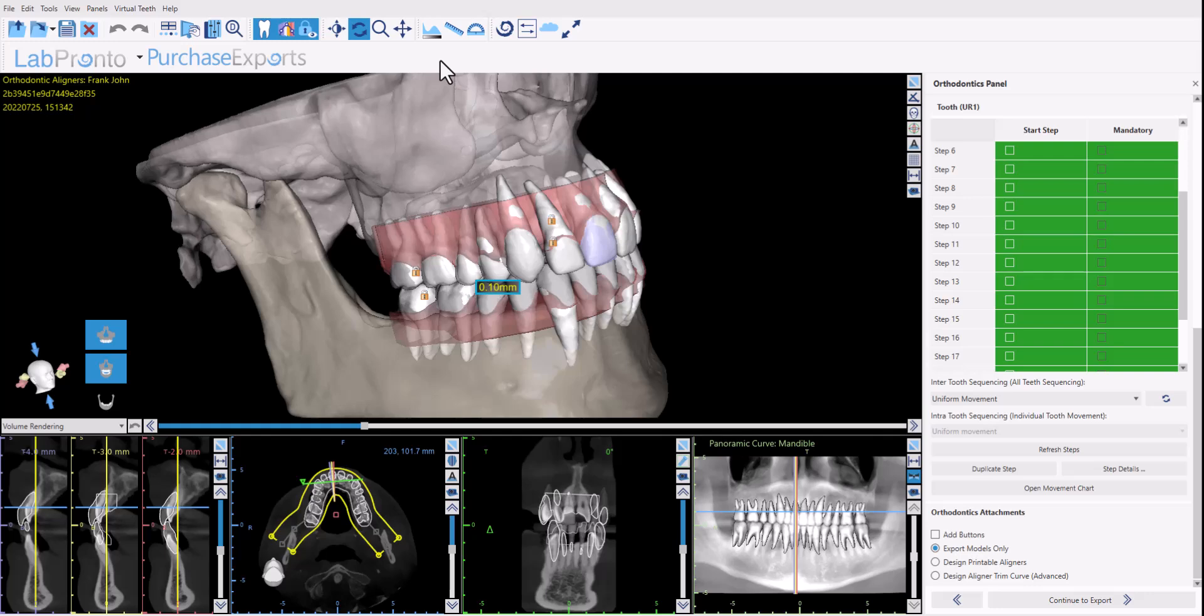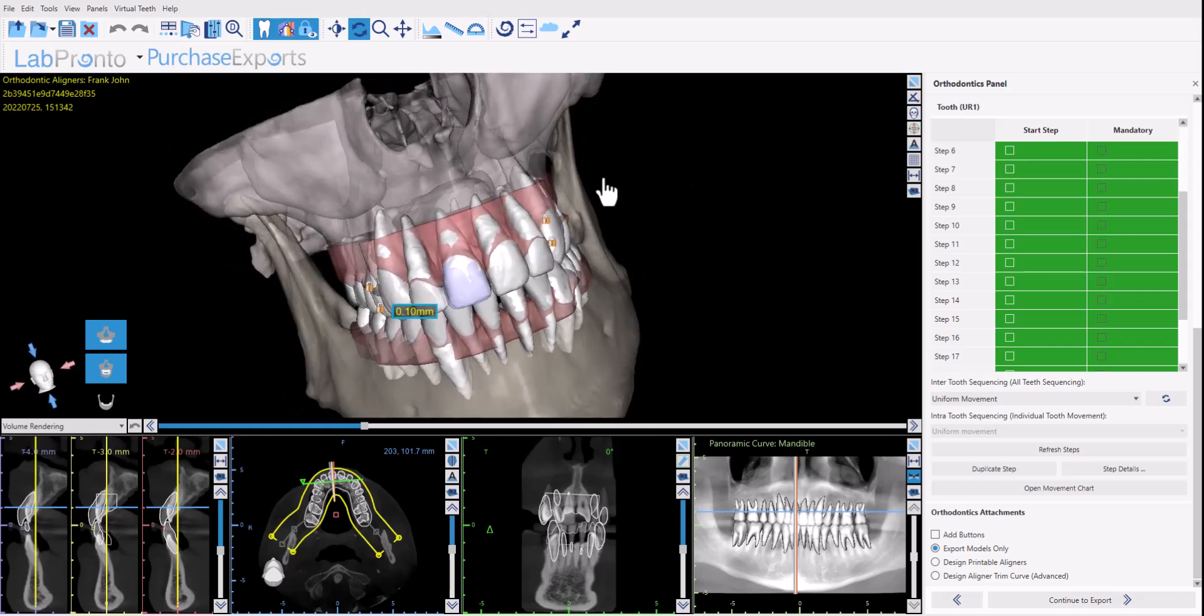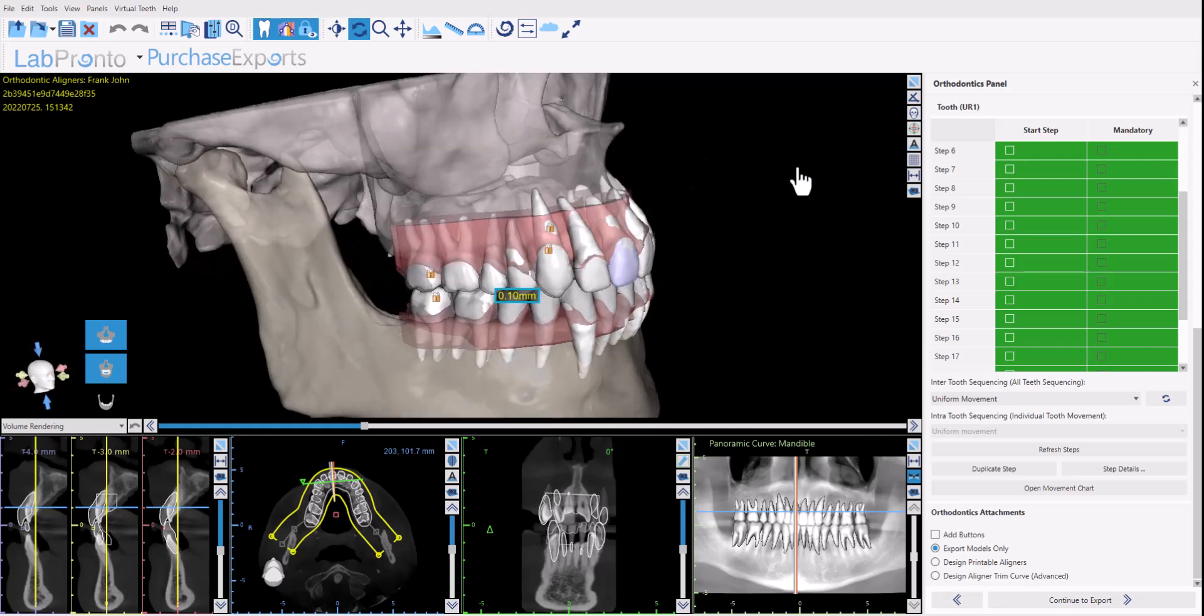In previous tutorials I've already discussed the automatic data preparation steps to prepare all the data for the teeth setup completely automatically. I've also described and presented our new functionality to do the automatic tooth setup. We've also discussed the advantages of adding a CT scan and importing a CT scan when aligner planning.